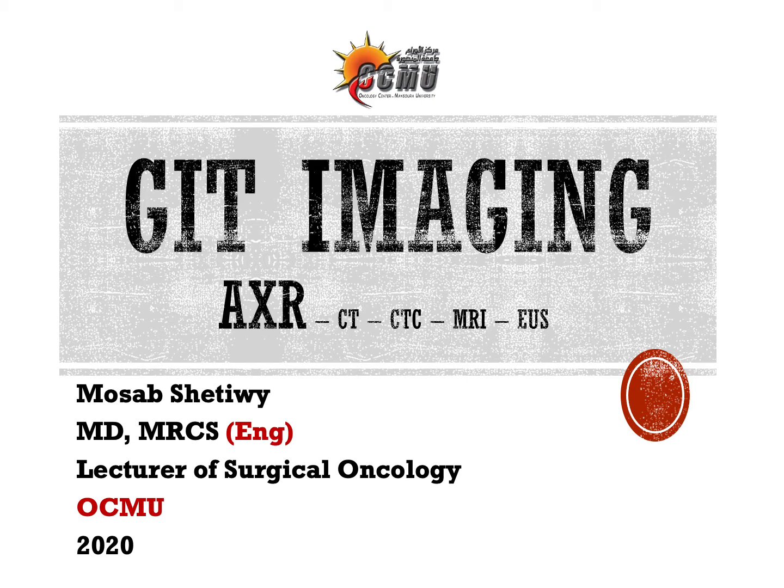In this topic, we'll be talking about the plain abdominal X-ray, plain X-ray of the abdomen. That's the X-ray of the abdomen without dye. We'll have a quick look at the CT with contrast, CT colonography, and a few slides about MRI and EUS as well.